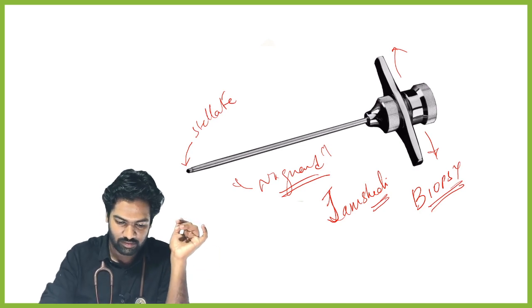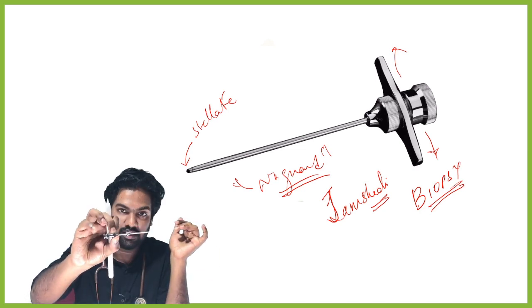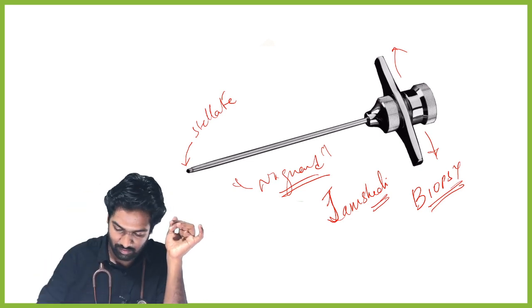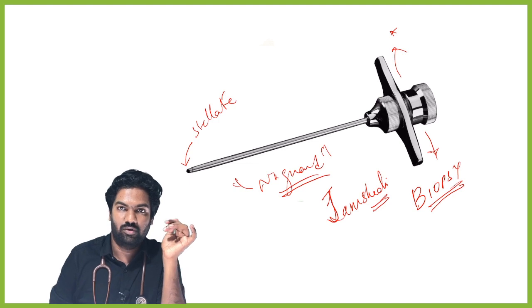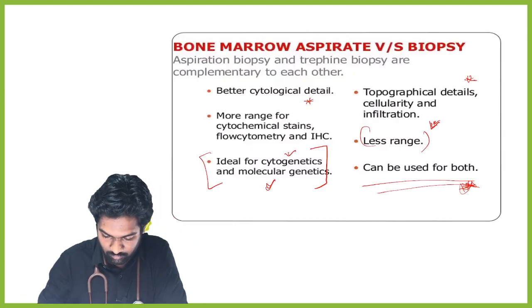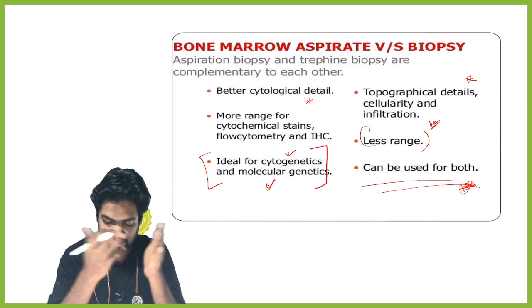The Jamshidi is not there. This is the aspiration needle only, the bone marrow aspiration needle. We don't have the Jamshidi needle right now. So it's like aspiration and biopsy.